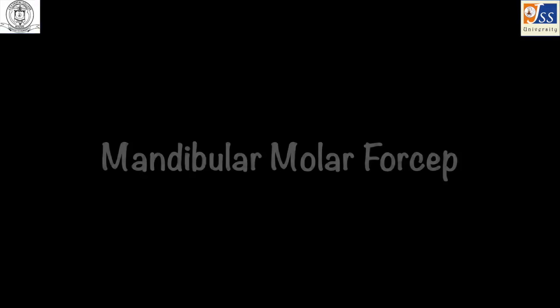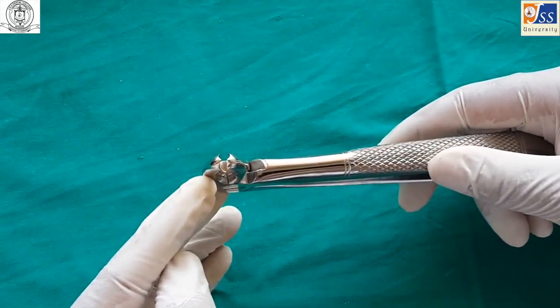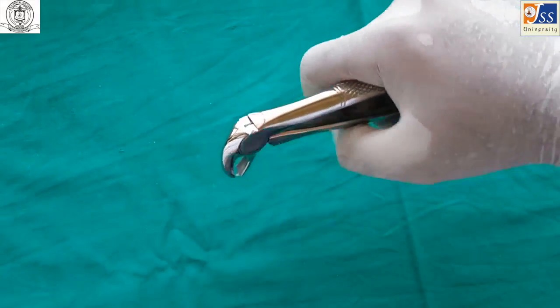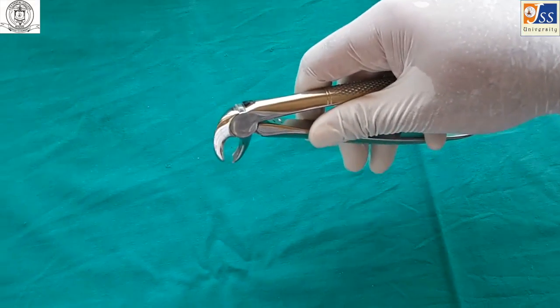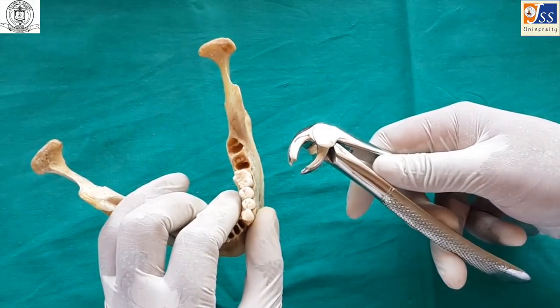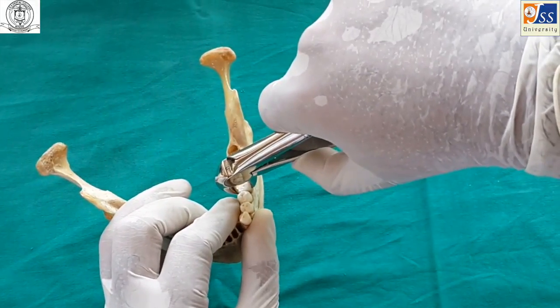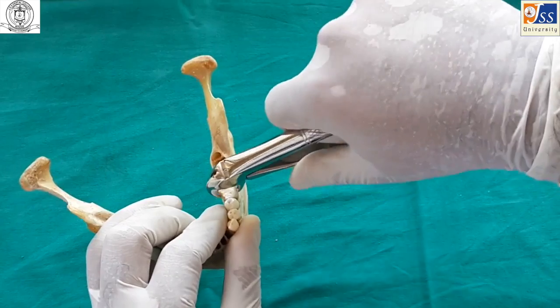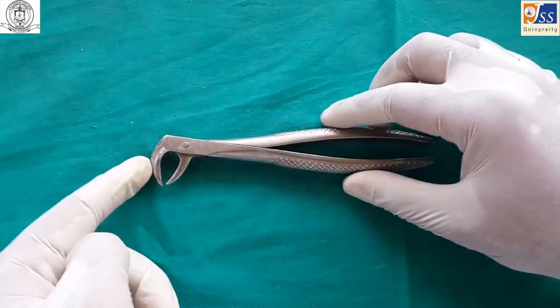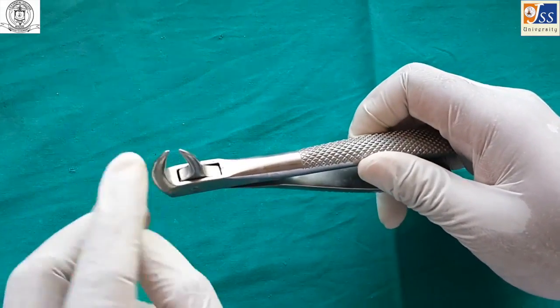Mandibular molar forceps is a single instrument which can be used for both sides. Mandibular cowhorn forceps is also a single instrument for both sides and is used in cases of grossly decayed teeth.